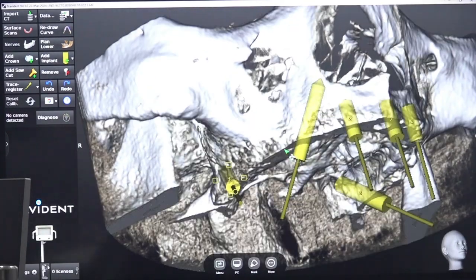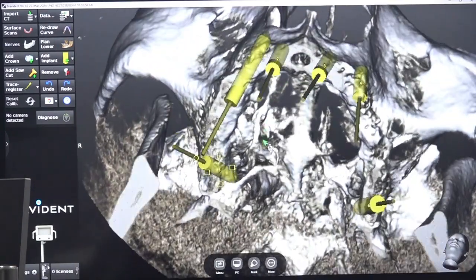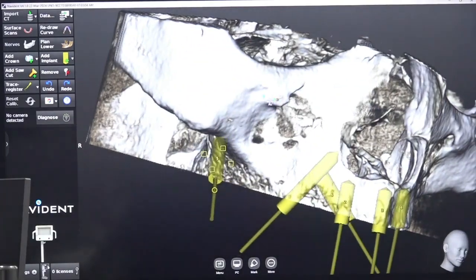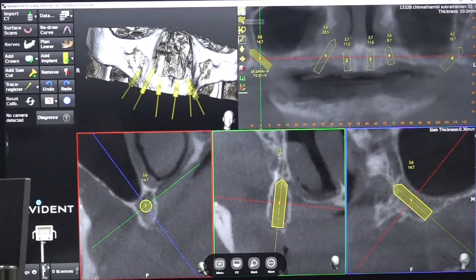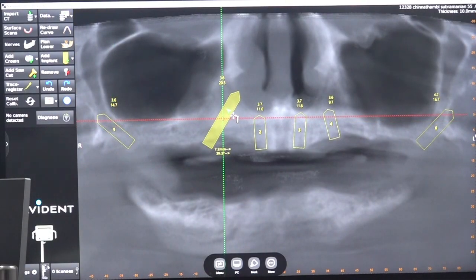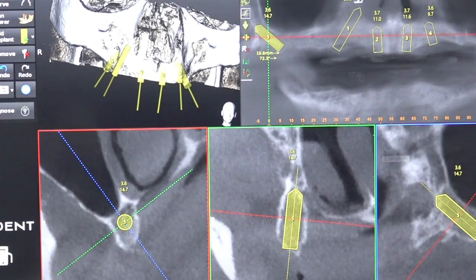So patient age 54, he lost all the teeth by periodontitis, and for the first 1 year he is wearing a denture. Both these conditions lead to severe atrophy of the maxilla, both in the width and in the height. So we will plan this case, even though it looks like there is good bone, but the height is very much compromised. Even the pterygoids are looking challenging.